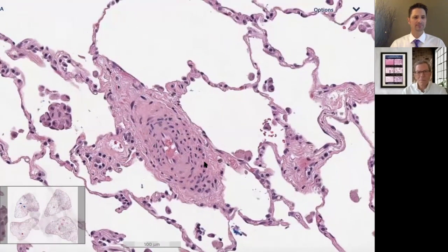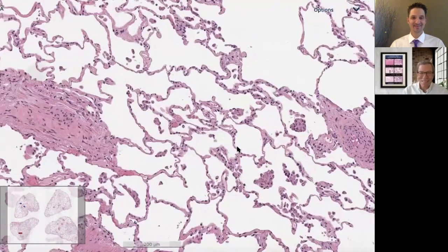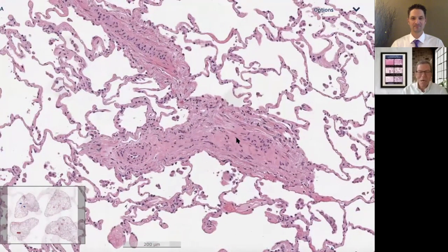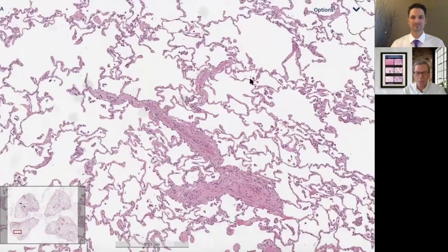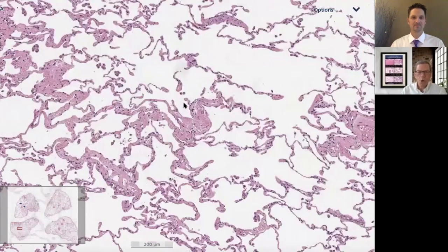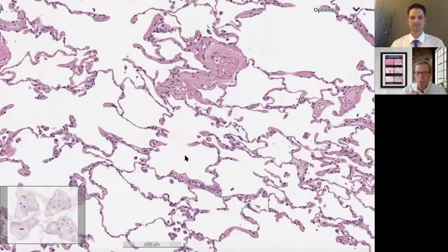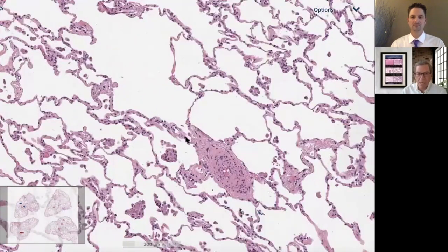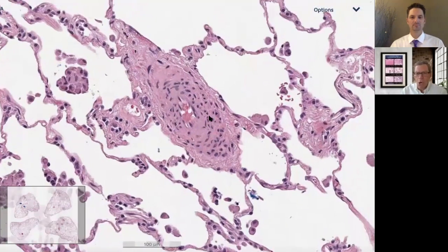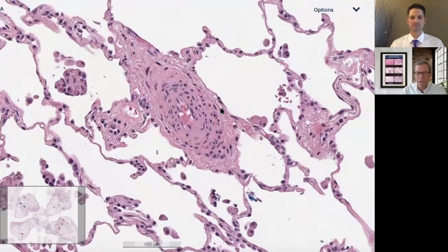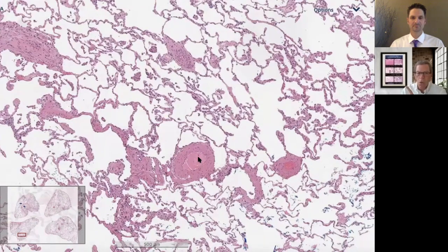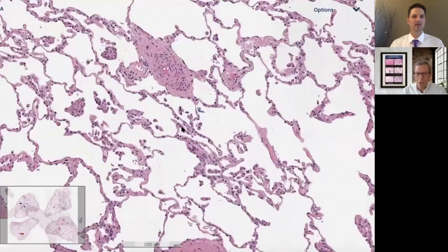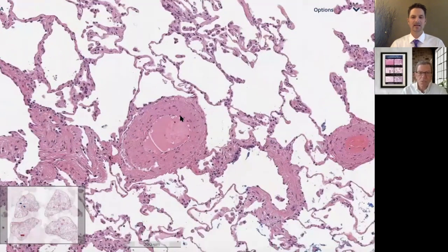Normally the only place you see pulmonary veins is subpleurally or in the interlobular septa — often only if they're abnormal, because the interlobular septum can be very thin and delicate, with not a lot of muscle normally. But we're seeing all of these post-capillary venules and they're not entirely normal — in fact they look like cellular pulmonary arteries. If you were thinking these are hypercellular pulmonary arteries, go to the nearest airway you can find and look at the artery there — that artery only has some mild wall thickening. We're really not seeing the same degree of abnormality in the pulmonary arteries as in the veins.